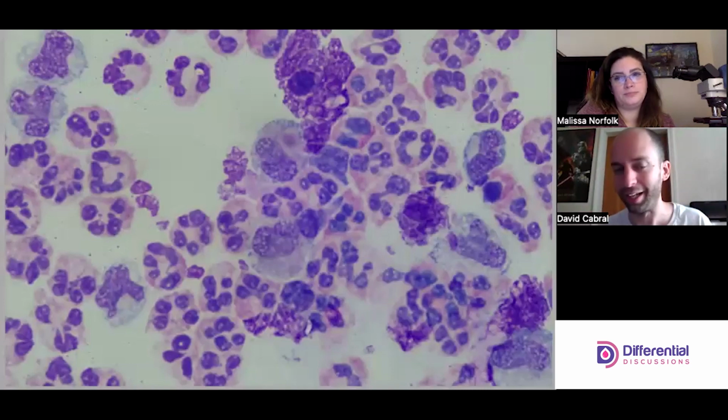I personally don't buy it. So yeah, we'll lump those together. We're going to be easy mode, I guess. But yeah, so I see neutrophils, I see some monomacs, and we'll probably come across a lymphocyte or something as we go, but I don't necessarily see it in the field.